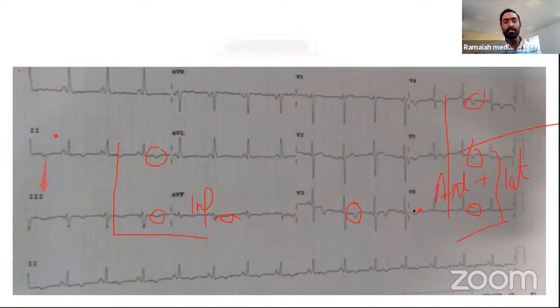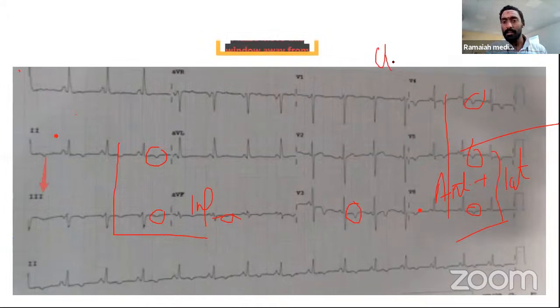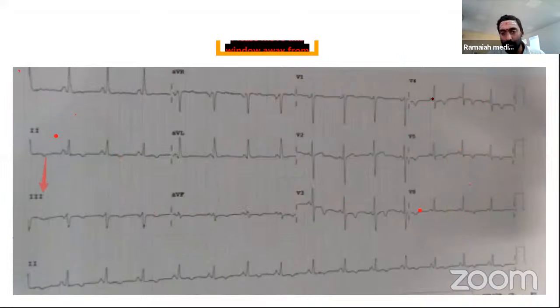So you have to see based on the clinical setting. One more most important thing is always interpret ECG in the background of the clinical setting. One ECG may have 1,000 findings, but what is the clinical setting in which it was done? That is what matters. So this patient, we don't know. I don't remember the history for this. Maybe if he has some chest pain and all, with some T wave inversions here, it has to be further evaluated. Okay, good.